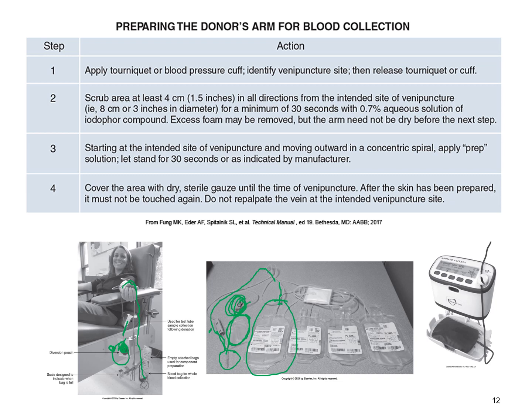Now, what you see here is a little device. Once this comes out of the patient, you can see the bag is here, but it's usually laid on some kind of tray, or it's weighed in some way, where once it reaches a certain volume, you have this little device right here that will clamp that and seal it off so that you're not taking too much out of that donor. And of course this little tray will actually rock while it's being collected, so you'll see it shift from one side to the other, just to keep that blood mixed with the anticoagulant that is inside of these bags.